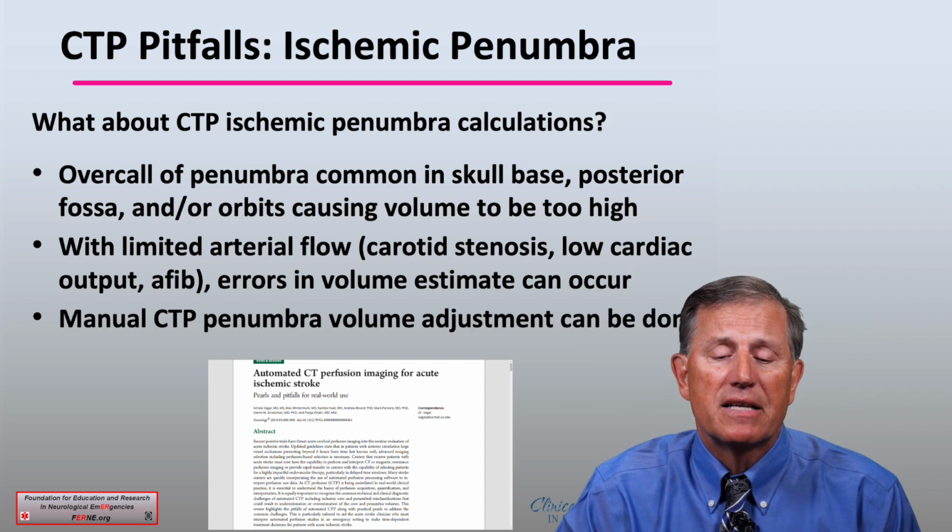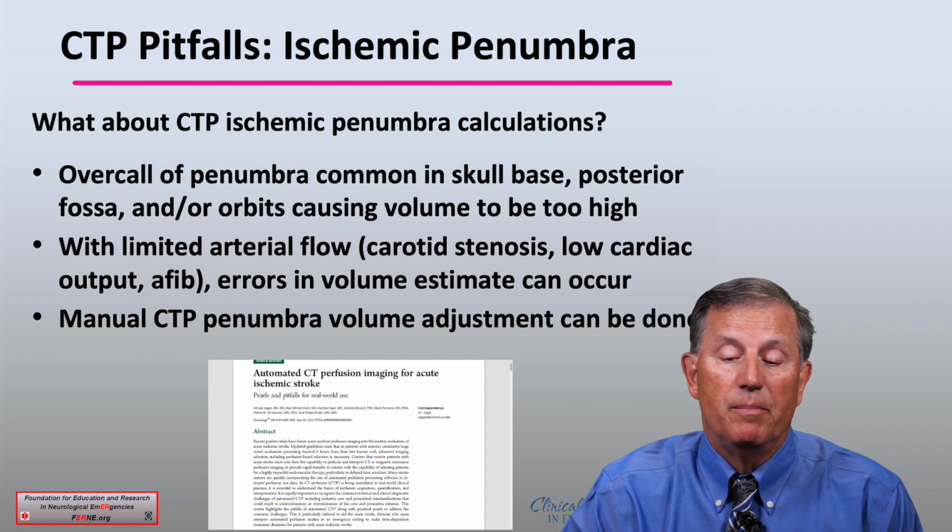And what about the ischemic penumbra calculations with CTP?